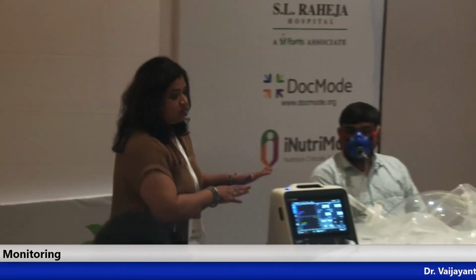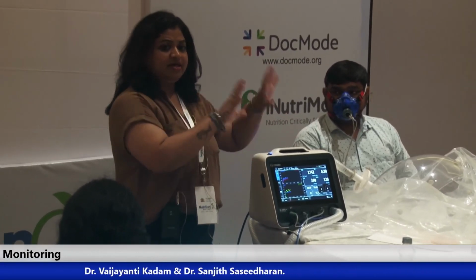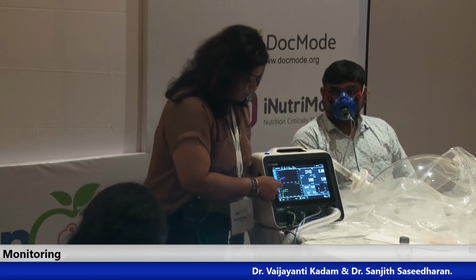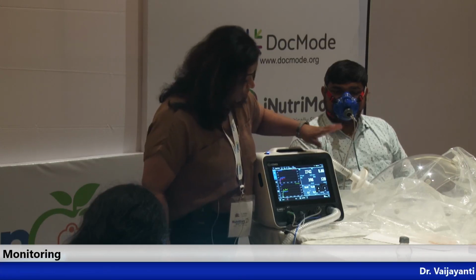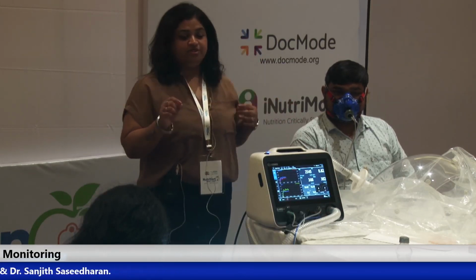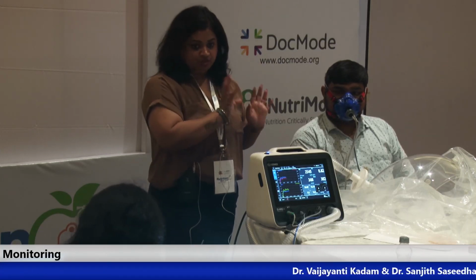the energy expenditure. As against this, here we get the energy expenditure very quickly, there is no need to keep the patient connected. You just connect for 5-10 minutes, we get the reading. In his case, we got the readings, and immediately see now, there's a graph which is going up and down, and his requirements are changing. So that means these are not accurate readings. Once we get these readings, we validate with the RQ of 0.8 and a variability coefficient of 5%. Then we know what our requirements are, what this is showing.